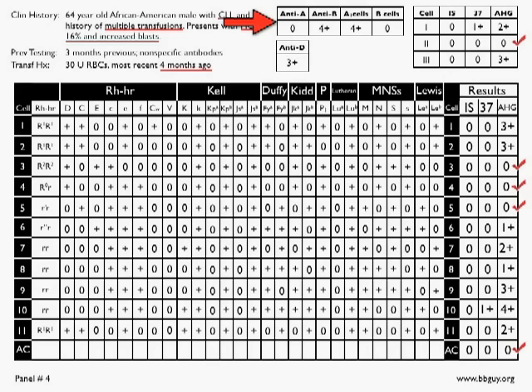He is group B, and group B positive. I can't allow myself to mess that up from now on. He's group B positive without ABO discrepancy. His antibody screen shows primarily reactivity at the AHG phase in both cells 1 and 3, and a little bit of reactivity at 37 in cell 1. More on that in just a second.